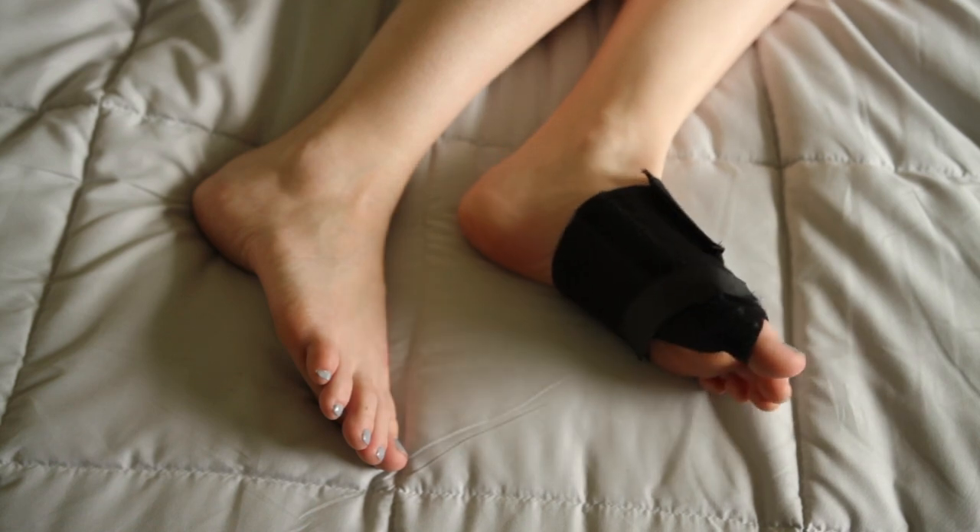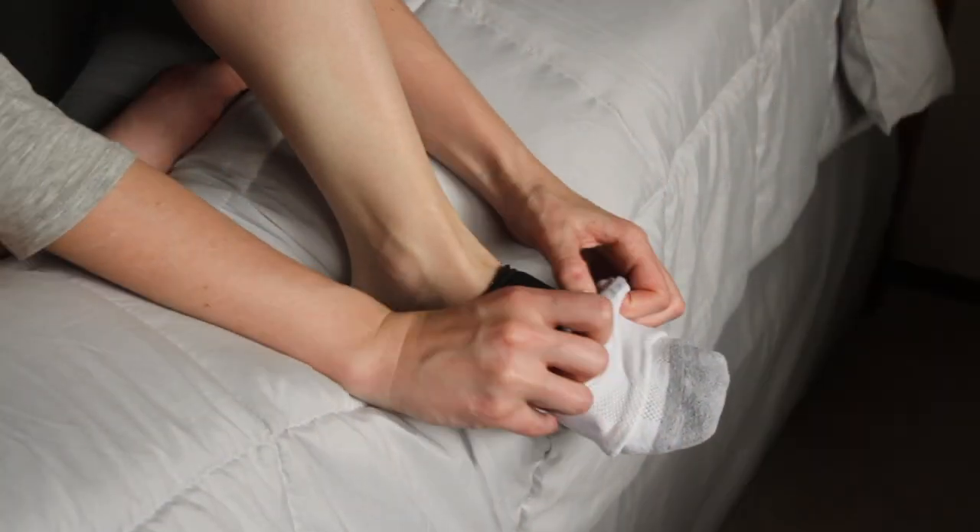Specifically designed to wear at night, but can also be worn in a sock or a loose shoe throughout the day if necessary.